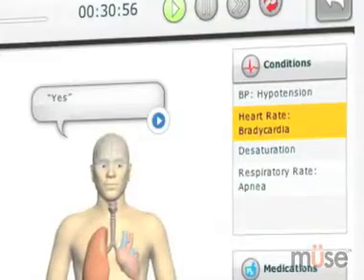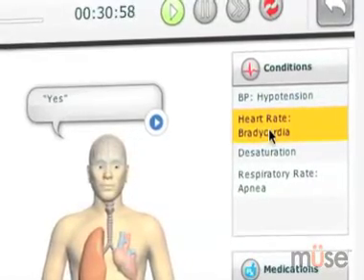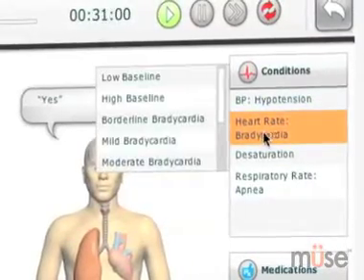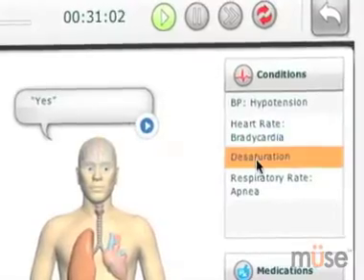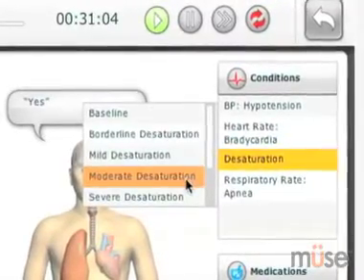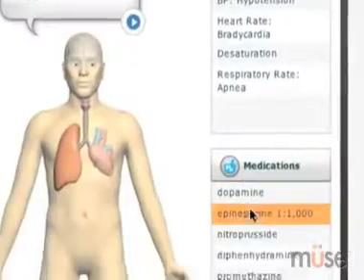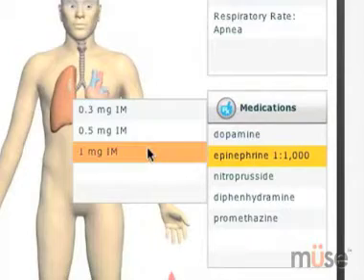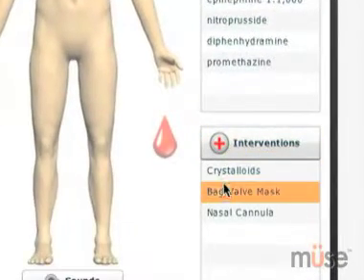You can also easily track the physiological status and events without having to move from screen to screen. MUSE's run screen gives you on-the-fly control of your patient's condition settings. Instead of manipulating individual physiological details, you can apply complex medical conditions with one click, while still benefiting from the full power of METI's physiological models. Medications and interventions are also at your fingertips and easy to control. And a detailed events log can be reviewed or exported at any time for debriefing and analysis.